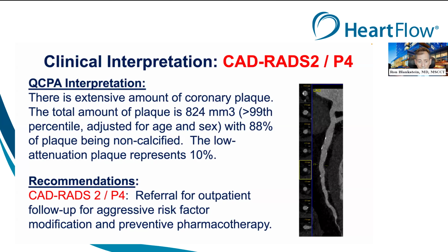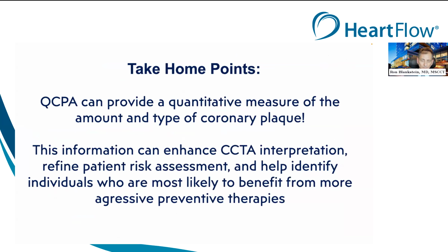We now put this, by the way, in every report, the recommendation. So this is the utility of plaque imaging, is that we can get a more precise estimation of the amount of plaque, and this directly ties to our recommendations.